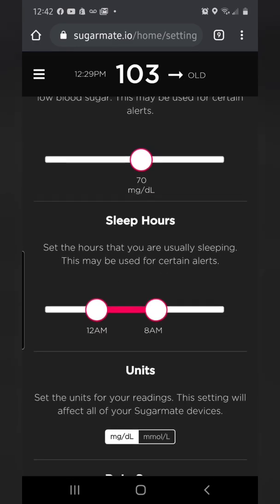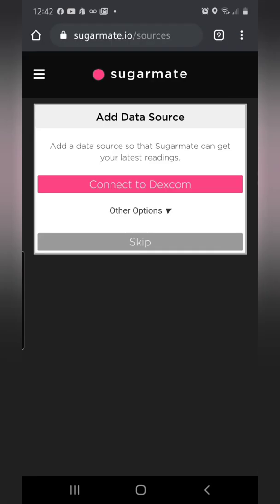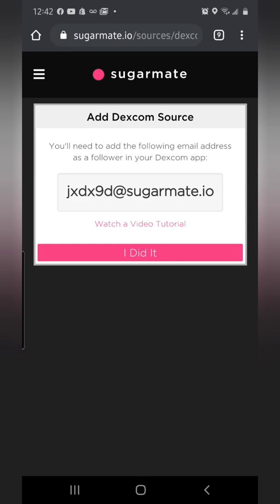Scroll down to 'Add Data Source' and tap that pink button — 'Connect to Dexcom.' What this does is create a link with an email address that you're going to input into the share section of your Dexcom app. Go to the share section where you invite people to see your readings — you can Google that if you don't know where it is. Input this email address, hit submit. Once you've done that, come back here and click 'I Did It.'